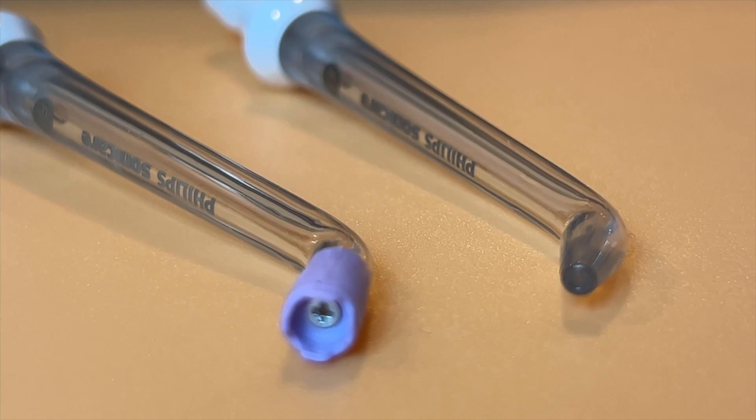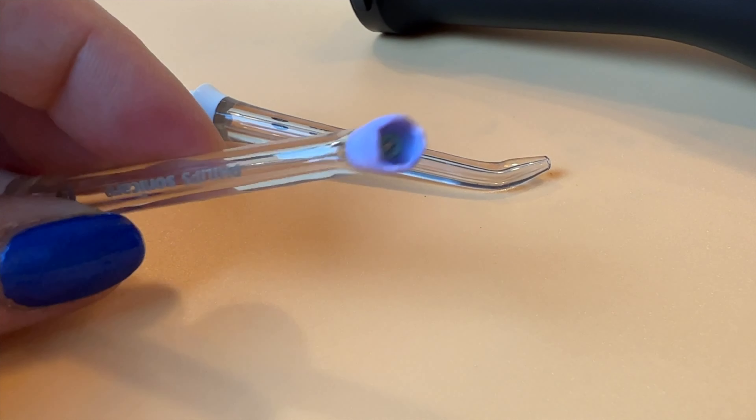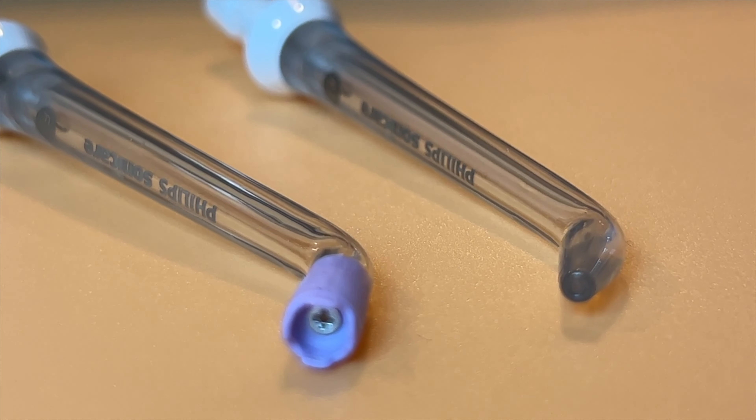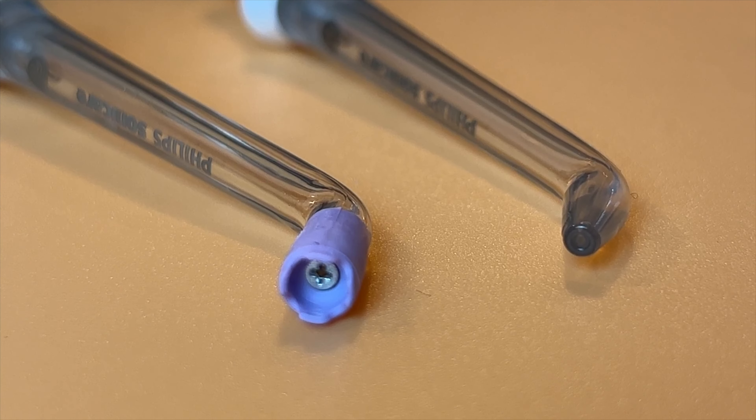Philips recommends you replace your flossing nozzles about every six months — the same as a toothbrush. Replacement nozzles cost about $25 each, which I think is probably the biggest downside to this device. They also seemed a bit hard to find. I can say I liked both of the different ends — the rubber-tipped one seems a bit softer and gentler with that quad stream, but what works for you will kind of just be personal preference.